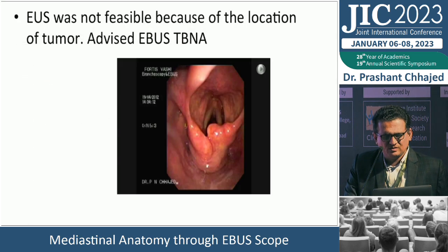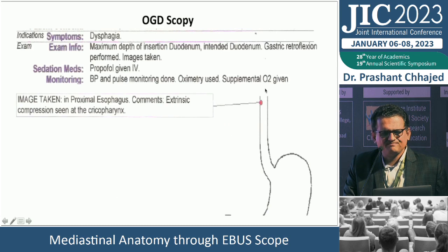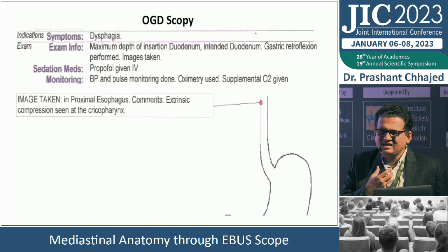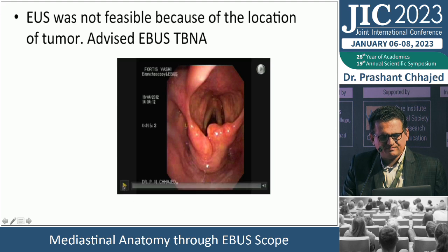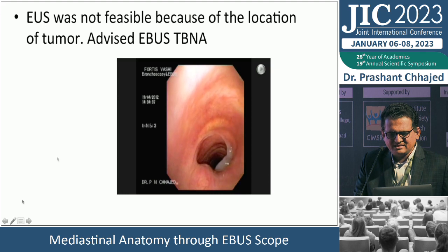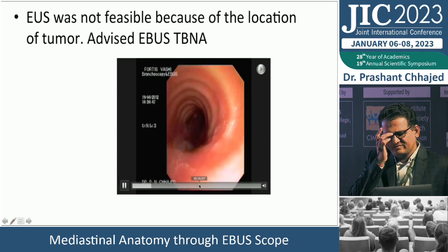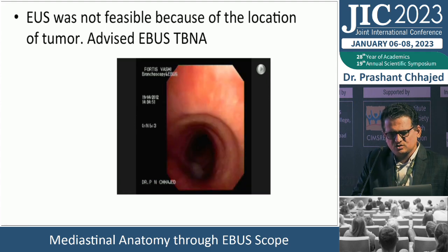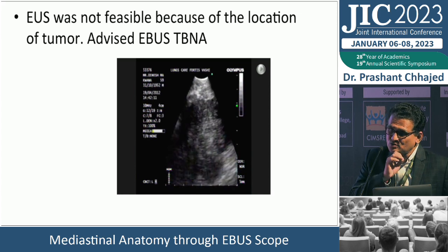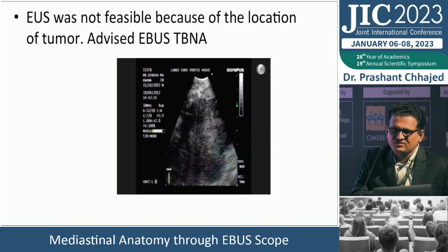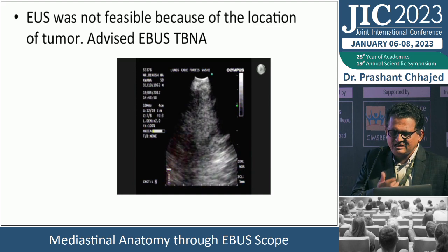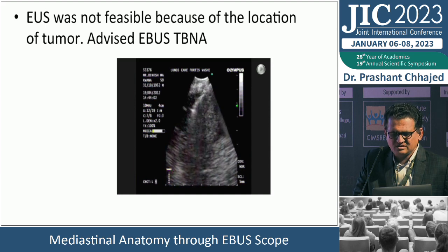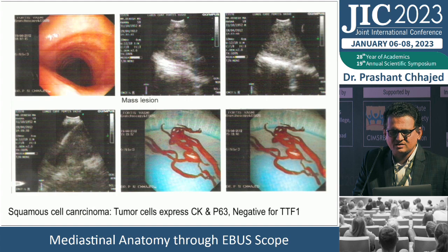Final case: a mass behind the posterior wall of the trachea that gastroenterology could not easily biopsy. White light bronchoscopy showed a bulge on the posterior wall. EBUS was performed through the posterior wall — not done routinely, but possible in selected cases with appropriate counseling. This was done approximately 10 years ago and yielded a diagnosis of squamous carcinoma.